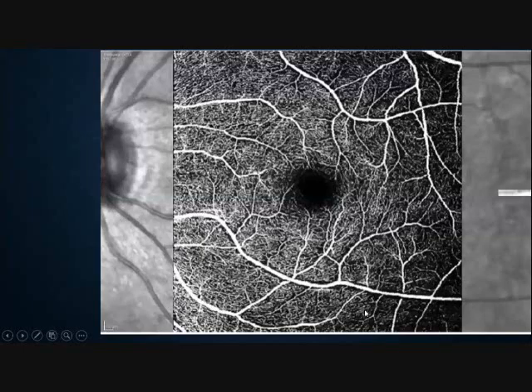Excellent. So what about this one? So OCTA angiography showing the foveal avascular zone.